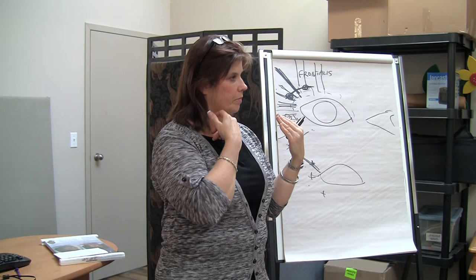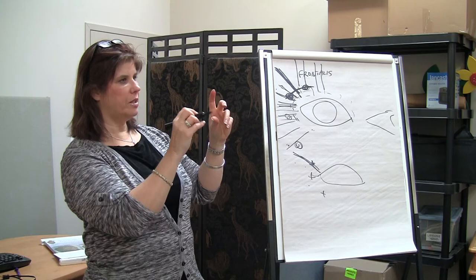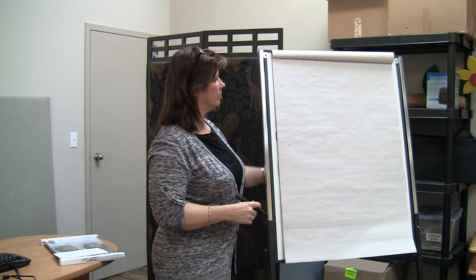Now, you'll come to a time where you don't have to make the dots anymore, but there are plenty of times, particularly on forehead, that I still make dots. Just because it's hard, you're doing the injections and it's hard to keep track of whether they're all straight across or whatever, so I just like to keep track. Anything else on that right now?